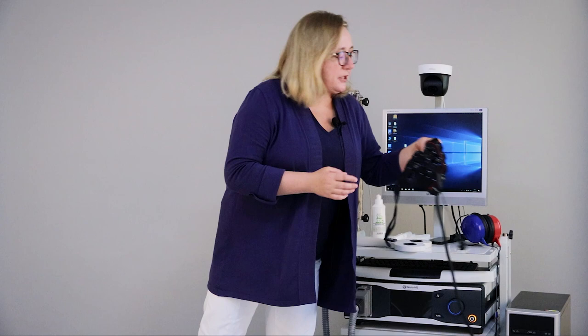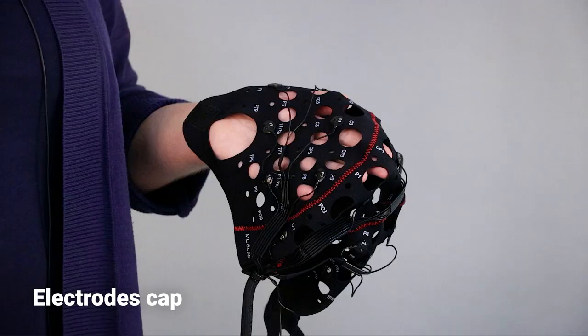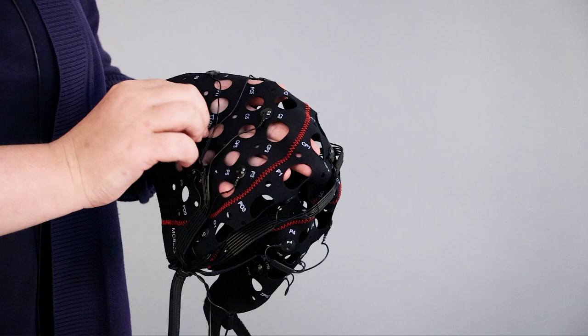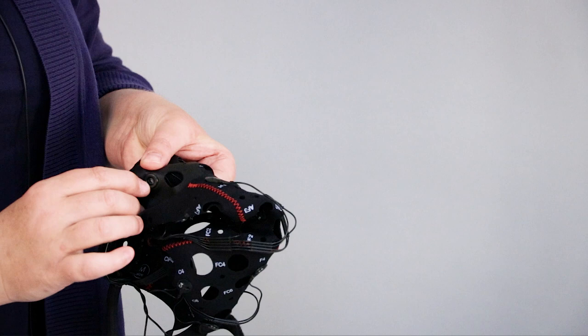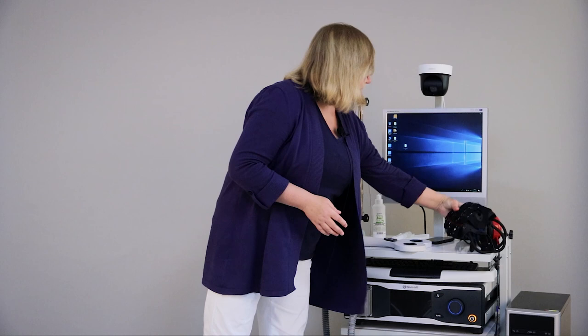Also, I will use special electrode caps. As you can see, the electrode is very thin and flat, and I can rotate them in any direction. Also pay attention — the shape of these electrodes is not ring.